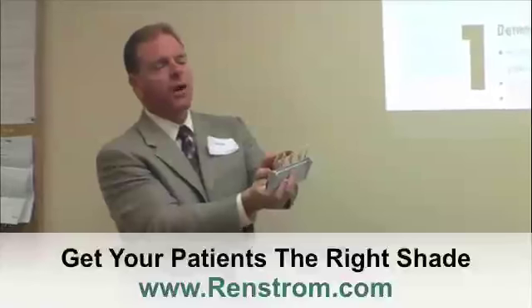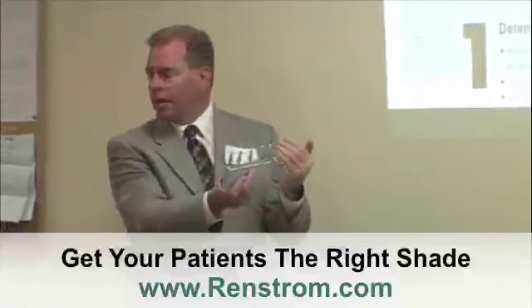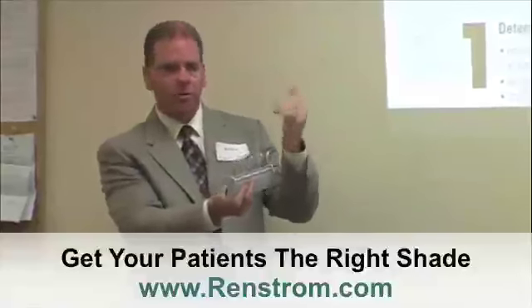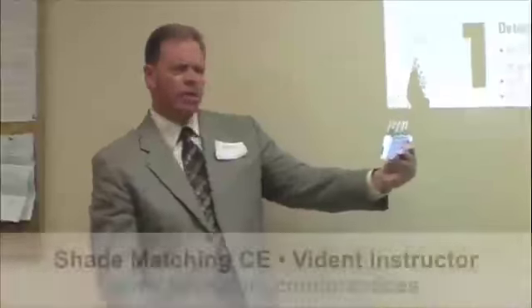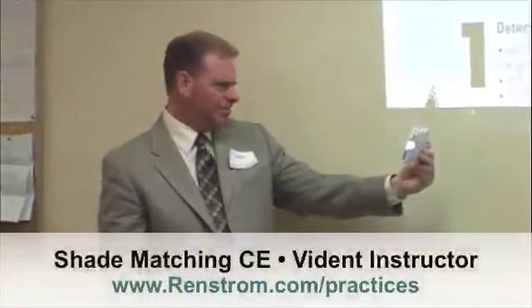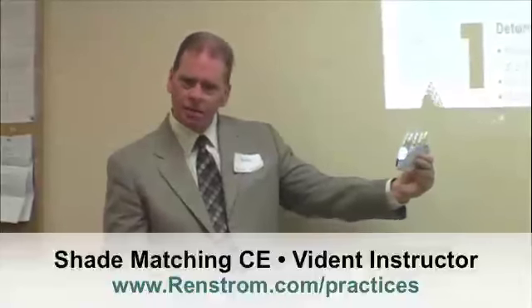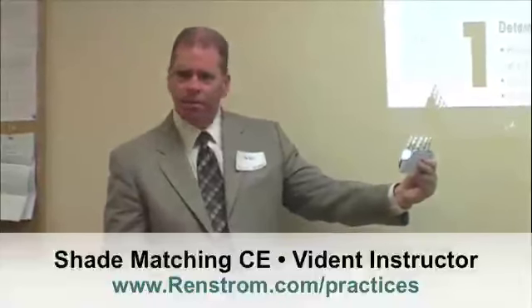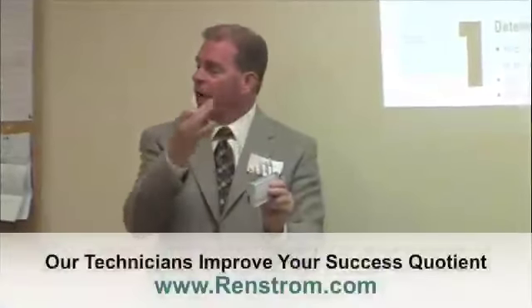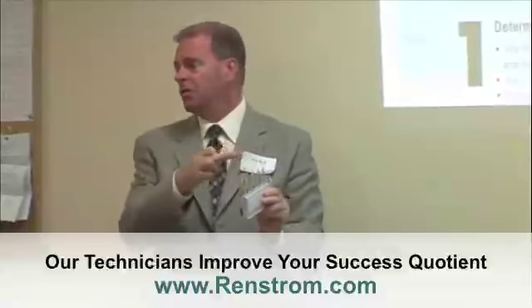Move down until you find the tab that you feel most closely matches just the value, the light and dark level, of their tooth. Now let's say we get down to 2. 2 seems a little bit too light, so let's go back to the 3 group. No, 3 seems a little dark, and you can't decide between 2 and 3. What will we select, doctor? 2.5. Correct. Halfway is roughly what our eyes can see the difference in, so we can do a 2.5.